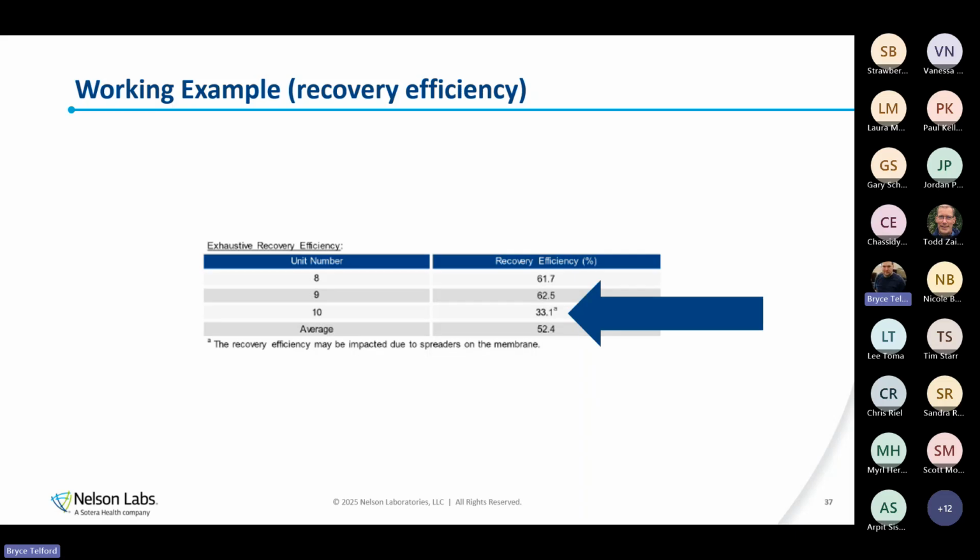So with EO, I have the most resistant organism. I have 1 million CFU of it, and it's in the most challenging to sterilize location. Do I care about my bioburden and ensuring it's controlled? Yes. But generally speaking, there has to be a lot that goes wrong for my bioburden to start becoming similar and comparable to that biological indicator. I have to have a considerable increase in my bioburden. And that's also something that Tony will talk about a little bit.